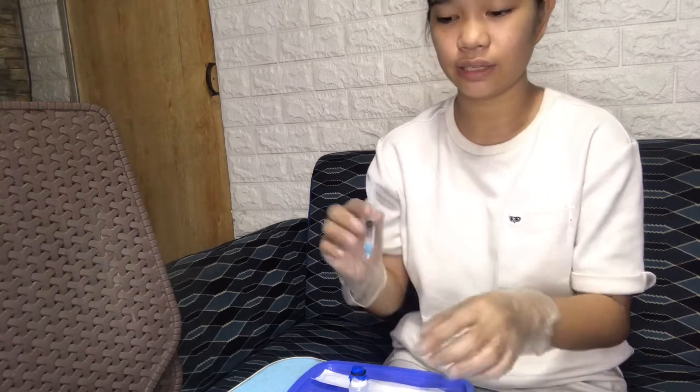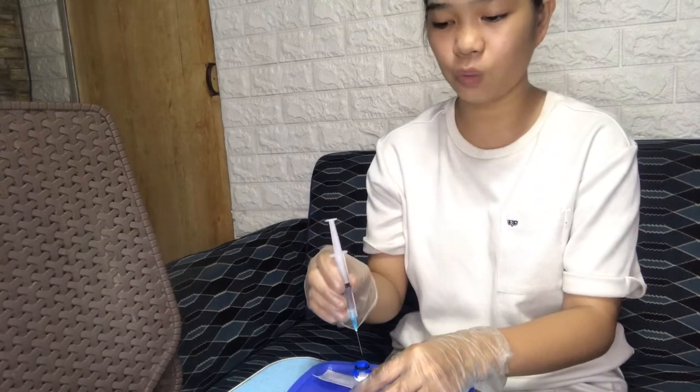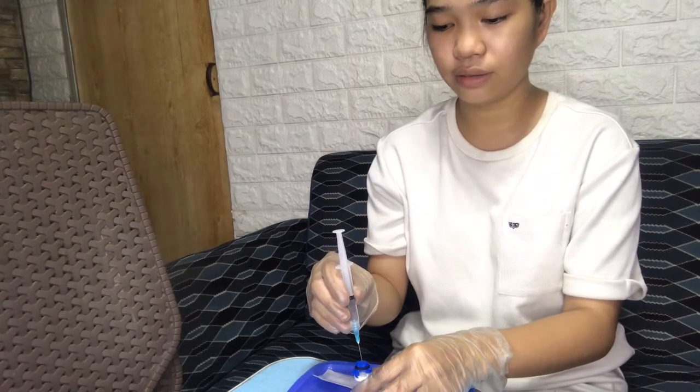Next is carefully insert the needle into the upright vial through the center of the rubber cap, maintaining the sterility of the needle. So the rationale for this is not to contaminate the vial or the medication. So let's put this one at the center of the vial. Inject the air into the vial, keeping the bevel of the needle above the surface of the medication.